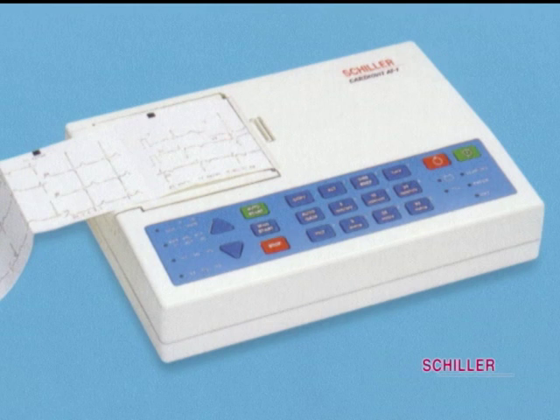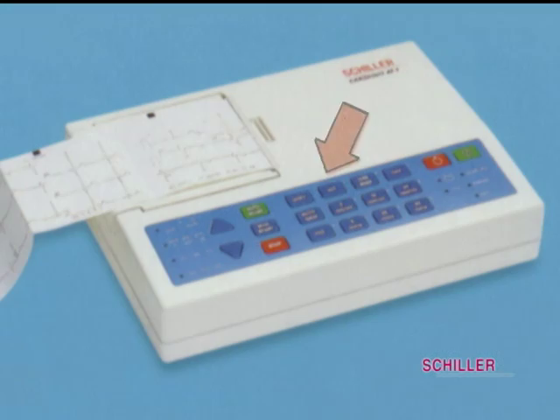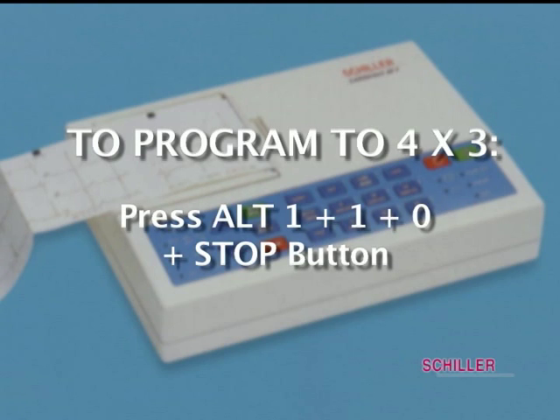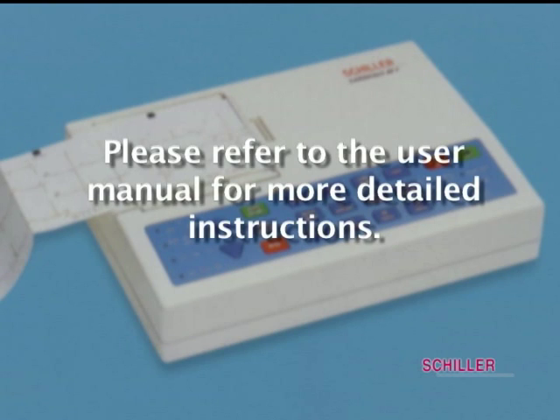To program the basic settings with AT1 and AT2, you will need to use the ALT key and refer to your user manual. For example, to program to 4 by 3, press ALT, 1, 1, 0 and the stop button. Please refer to the user manual for more detailed instruction.